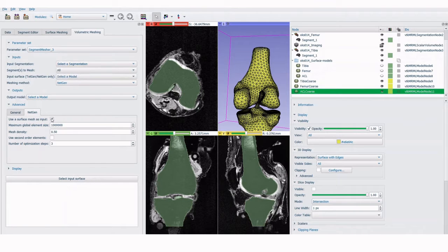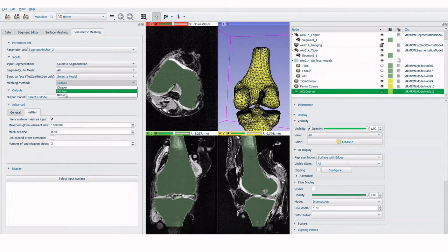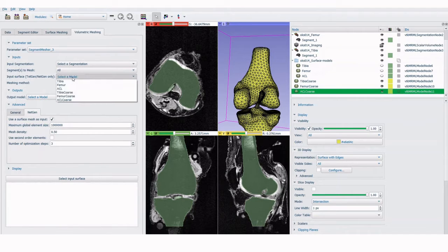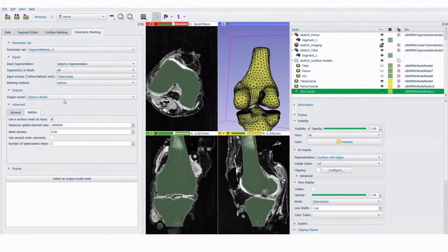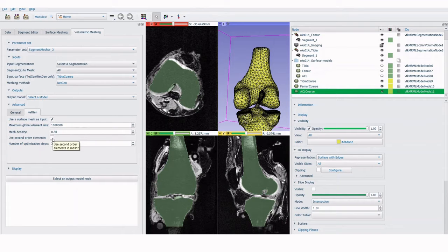In order to mesh an input surface, select NetGen or TetGen under Meshing Method. Make sure to check the box under Advanced NetGen Settings to allow a surface mesh as input. These advanced settings will also allow you to control portions of the algorithm such as mesh density and generation of second-order elements.